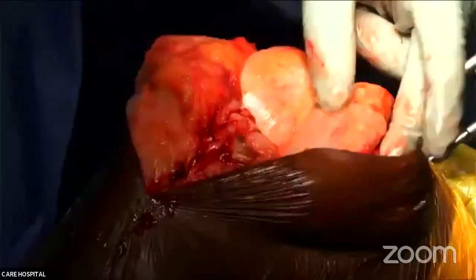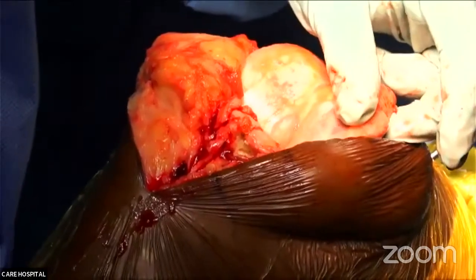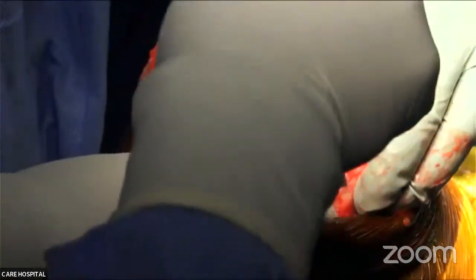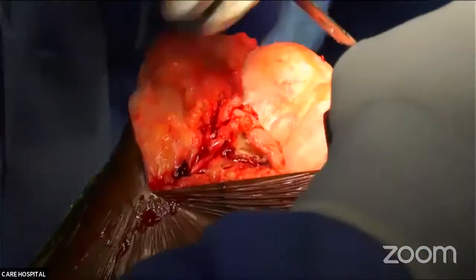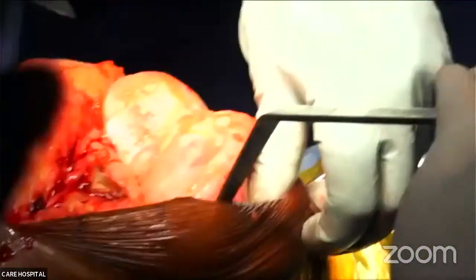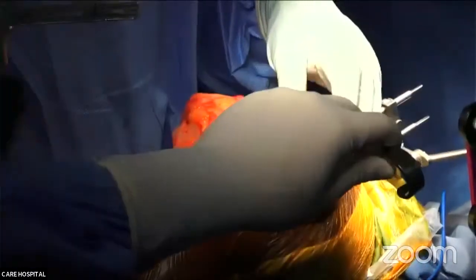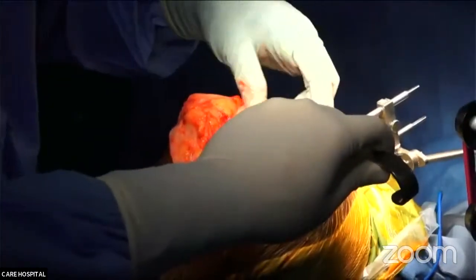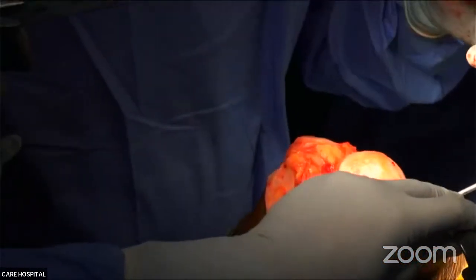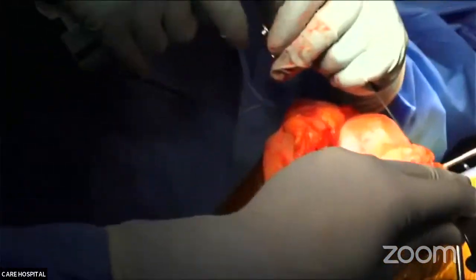Could you just briefly explain what is that RMSE point, which we need to mark after every registration? So that is basically root mean square error. It denotes the variation between your CT scan plan and the actual thing. If it is less than 1, that means you are quite accurate. Your registration of points matches with the plan which you have done on the CT scan.